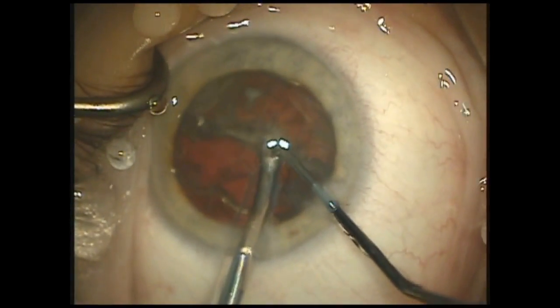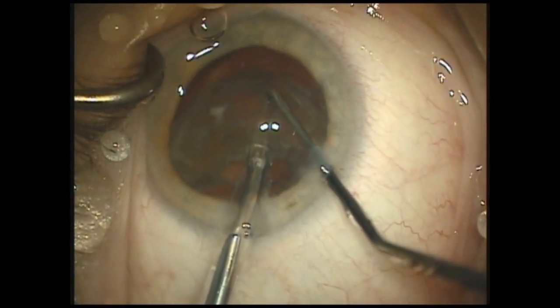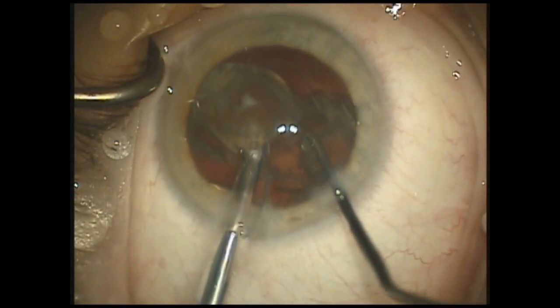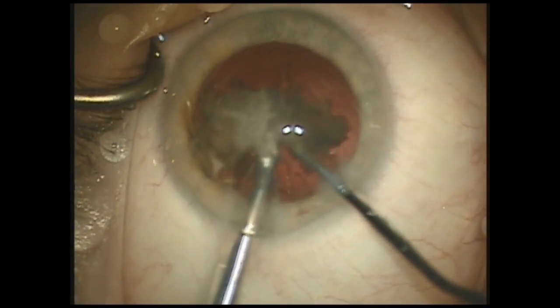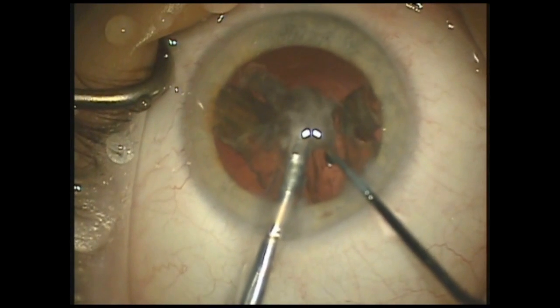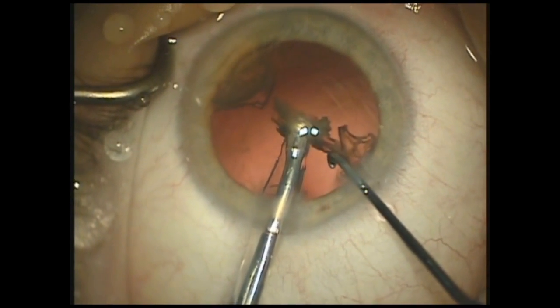Here again, you can see the strong holding power of the Stellaris system, utilizing as much vacuum as needed for chopping in the yaw position, and then coming back to the pitch position for lower vacuum levels to remove the nucleus and help prevent surge, especially during removal of the last pieces of nuclear material where nothing prevents the posterior capsule from jumping up to the FACO needle during post-occlusion surge events.